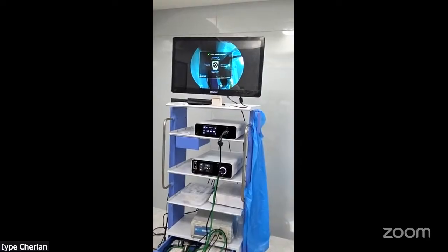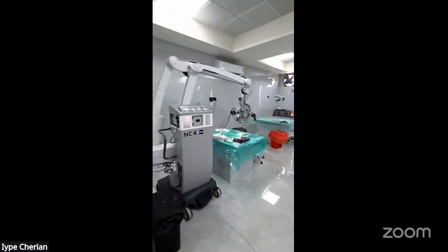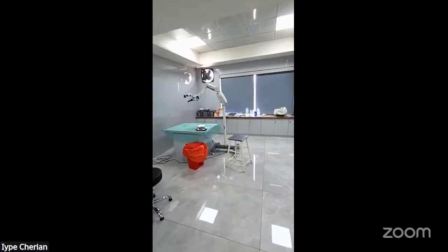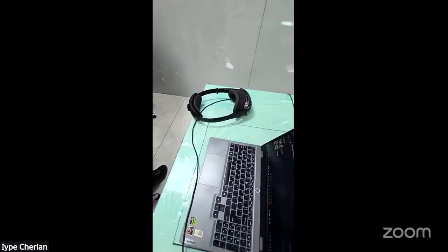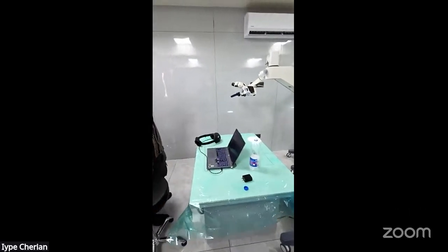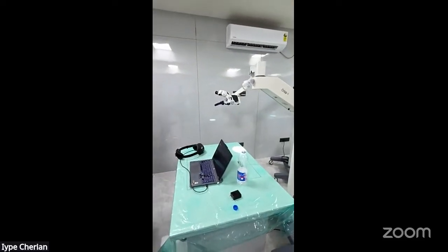That is very, very immersive. And you can see we are using this for teaching. This is an NC4 microscope for vascular anastomosis, and every station is equipped with a separate microscope. And here is what I was talking about, the Acer AR technology. We have already started using it here. We have machine vision, machine learning, everything with this headset. That will also be incorporated into the lab. It is one of the best labs in the world, if not the best.